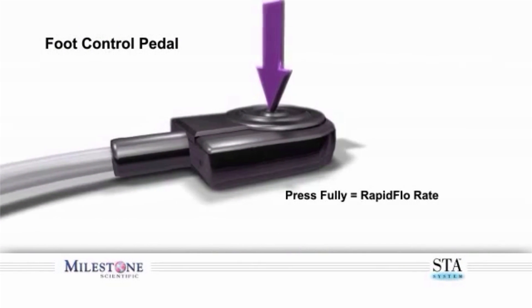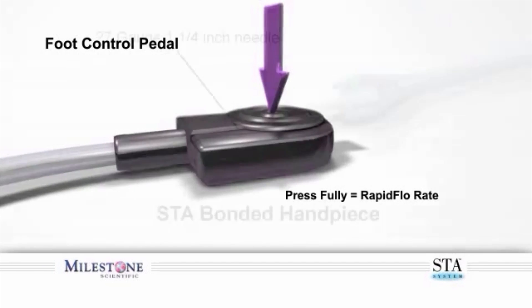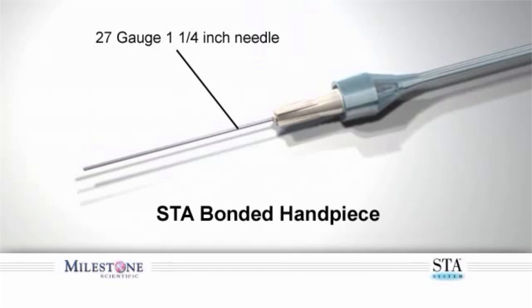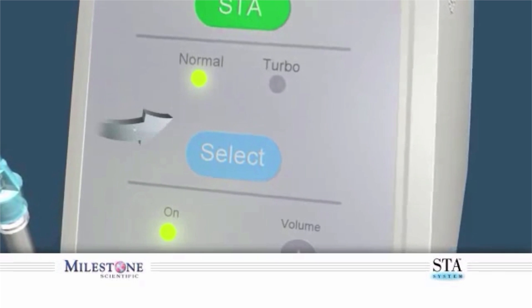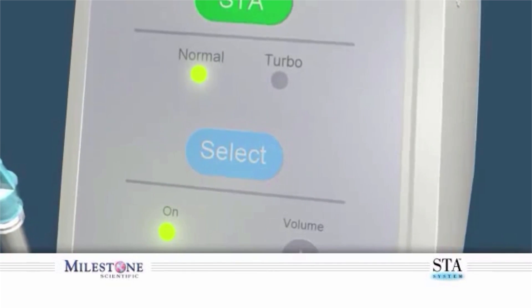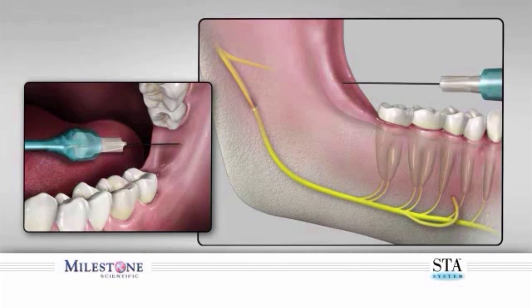It is recommended that you use a 27-gauge, 1¼-inch needle to perform the inferior alveolar nerve block. Set the wand to the normal mode. Approach the site as you would normally using the traditional anatomical landmarks of the oral cavity. To initiate the injection using cruise control, slightly depress the foot control.